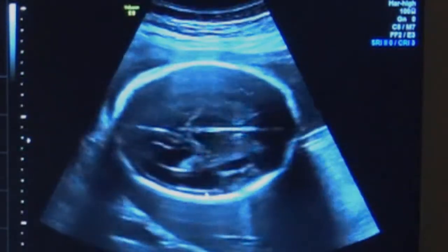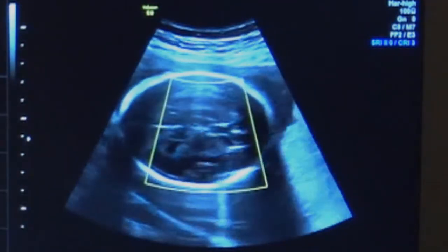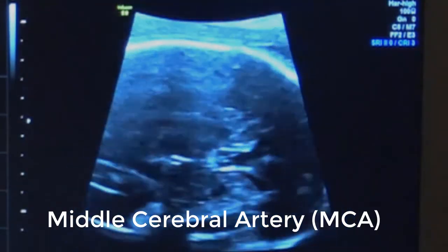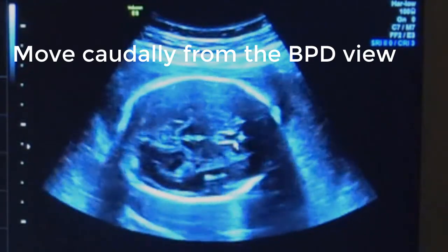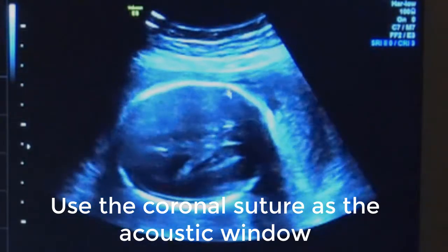So obviously we want to look at the MCA, which is good to use your HD zoom. So BPD, you've got your thalamus and you've got your cavum septum pellucidum here. You want to angle through that suture there.